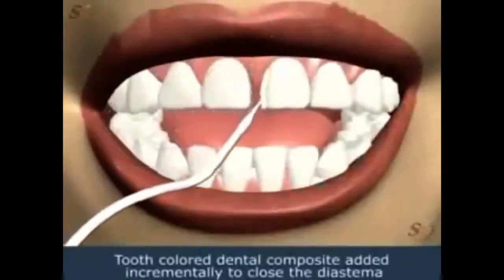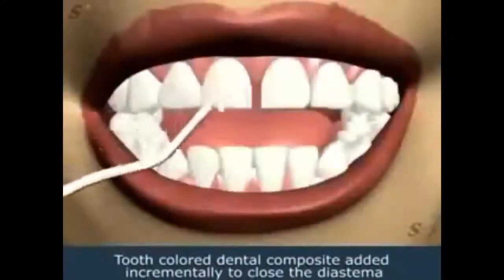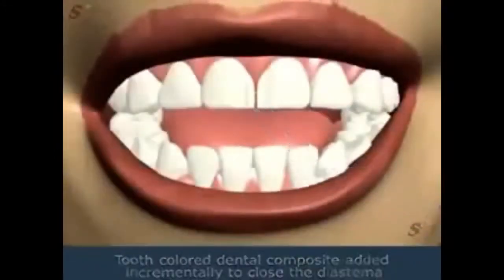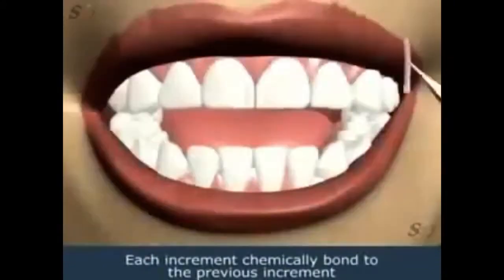Tooth-colored dental composite is then added to incrementally close the diastema. Each increment chemically bonds to the previous increment.